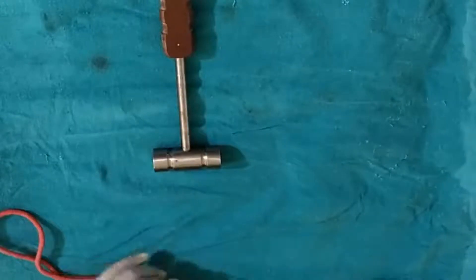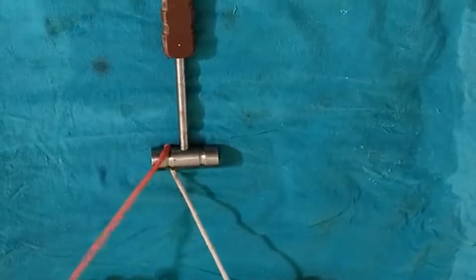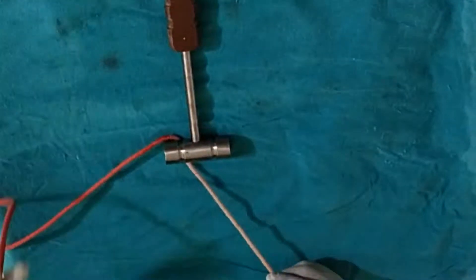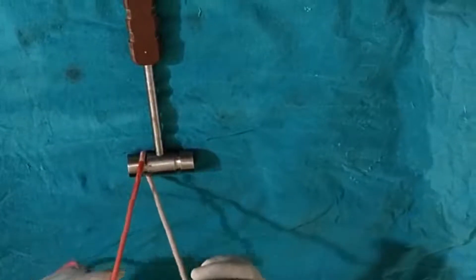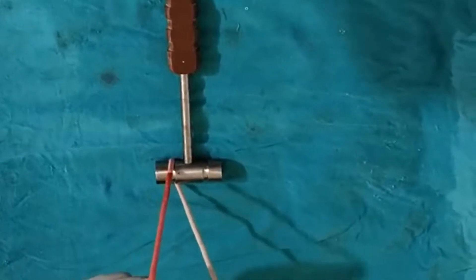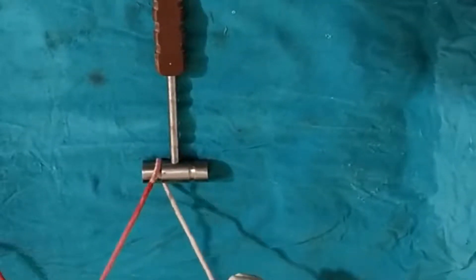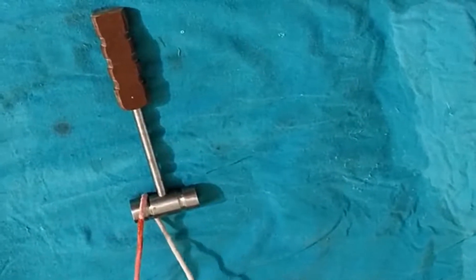For the one-hand tie, I have this long thread — this is the needle end and this one is the free end. I am holding the free end in the right hand between the thumb and index finger, and the long thread also between the thumb and index finger. One-hand tie means only one hand is engaged in tying the knot. Whenever we put a knot we always put the square knot, not the granny knot, so the pattern is very important.